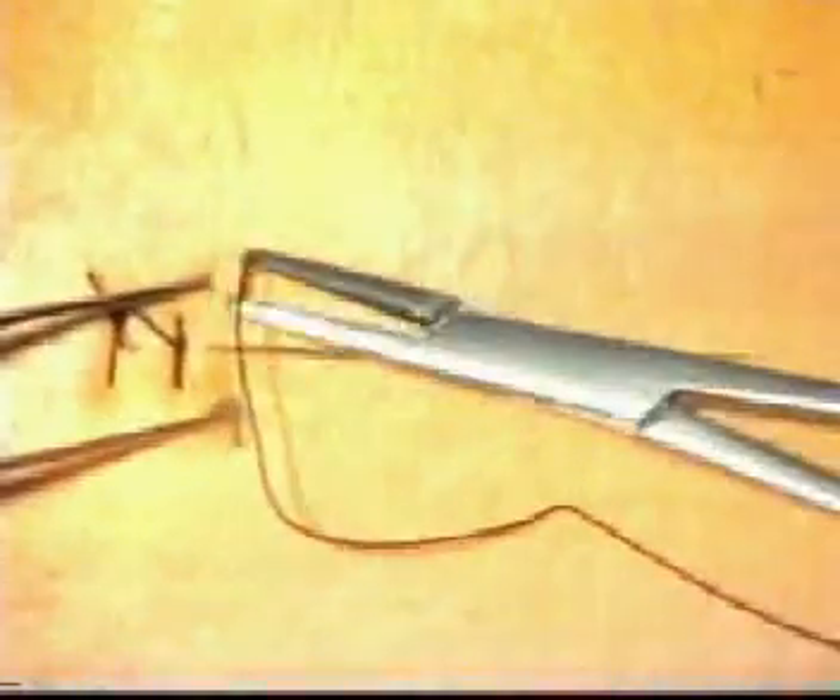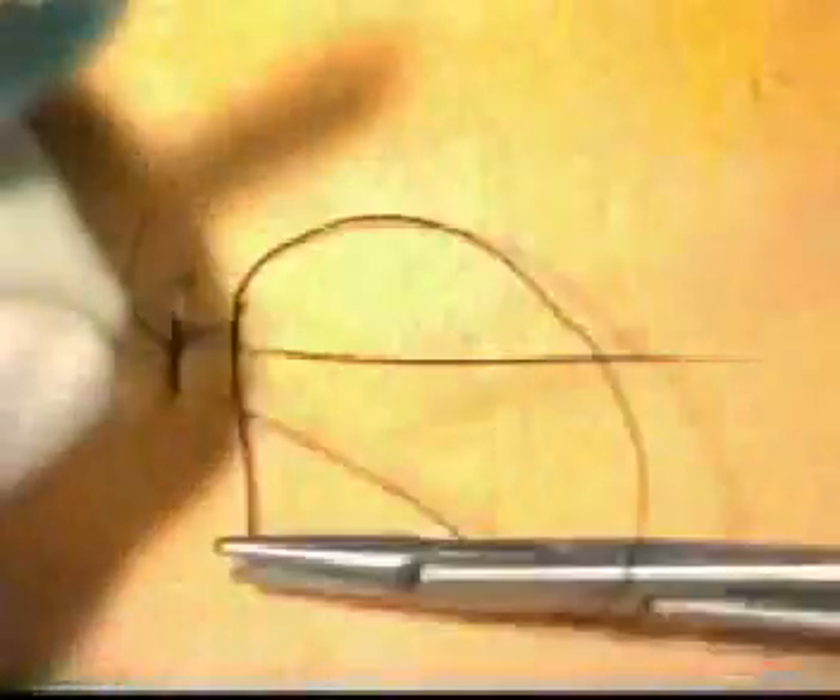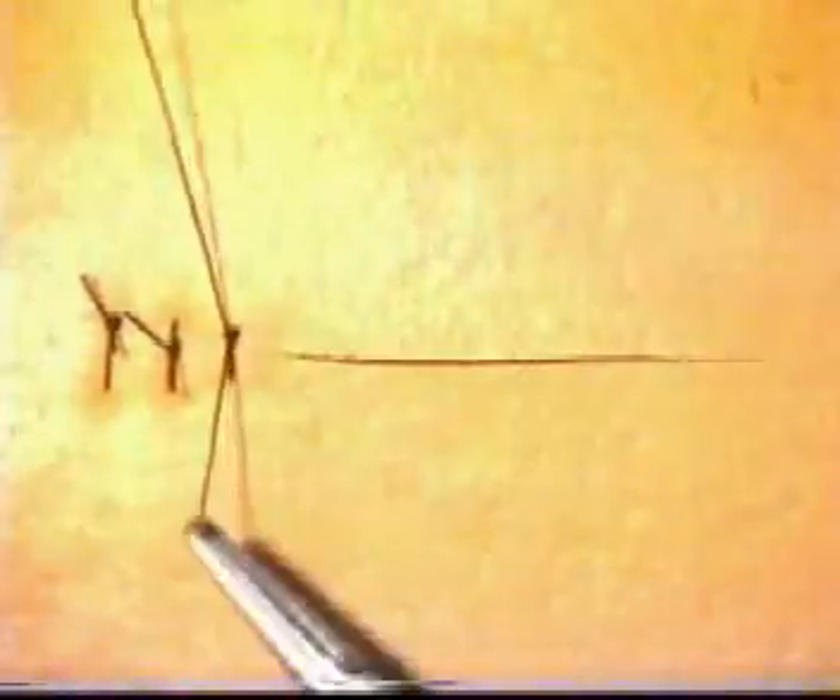Let's insert another suture. When the incision edges are as closely aligned as these, it is appropriate to go through both edges with one smooth movement. But as will be demonstrated later, this is not always possible, and often the edges need to be taken separately. Once again, tie a reef knot.